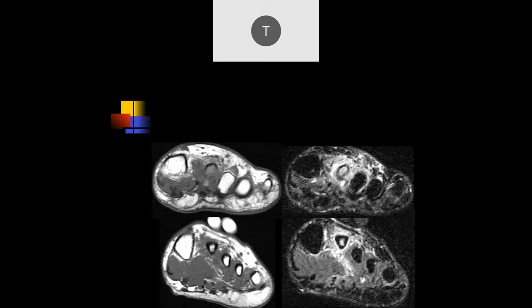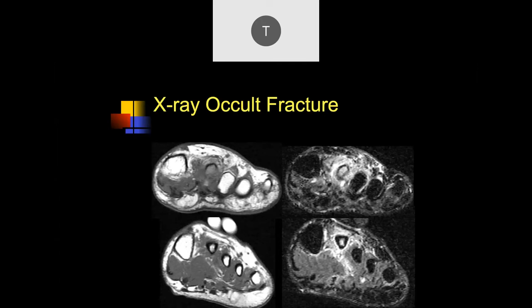There is marrow edema in the second metatarsal with surrounding soft tissue edema — I'd be worried there's a fracture here. In a case like this, you certainly have to be concerned about osteomyelitis, so you need to get the clinical history and make sure that's not what you're dealing with, because that could be a semi-medical emergency. History is important for these cases.